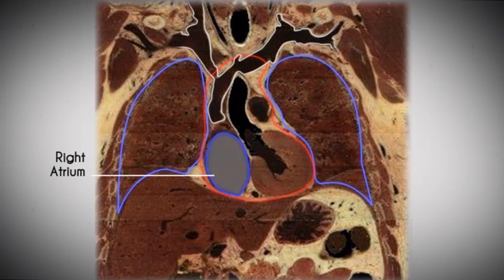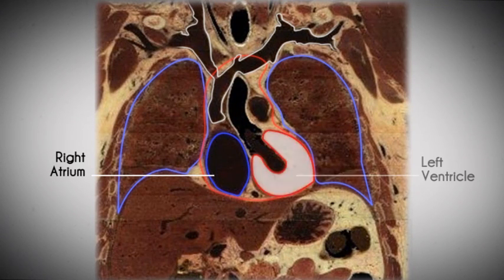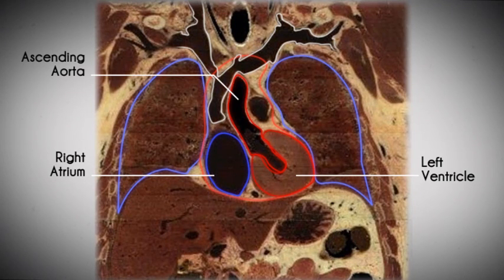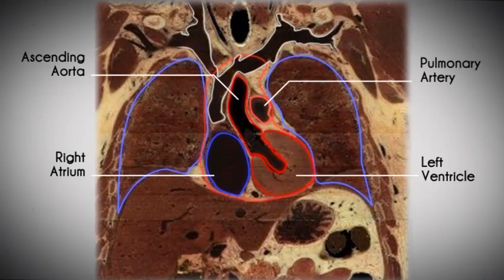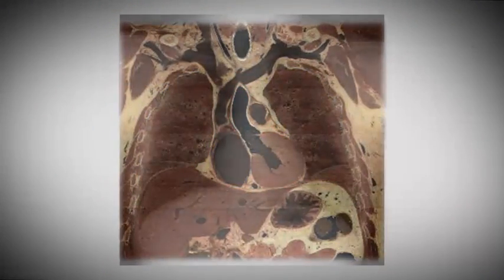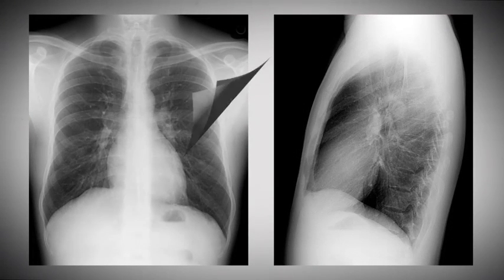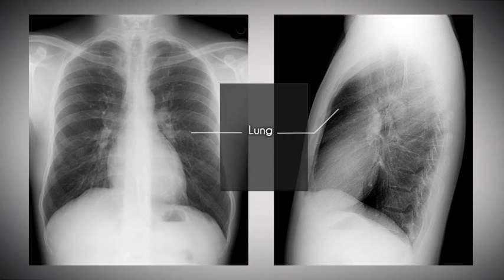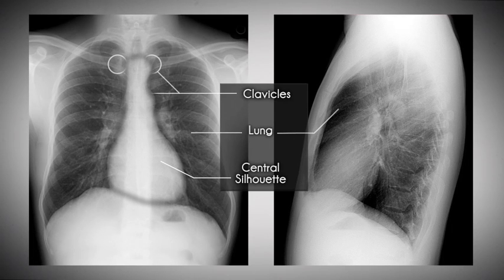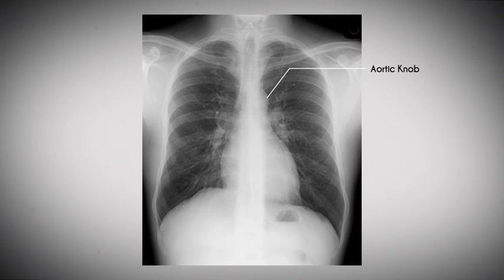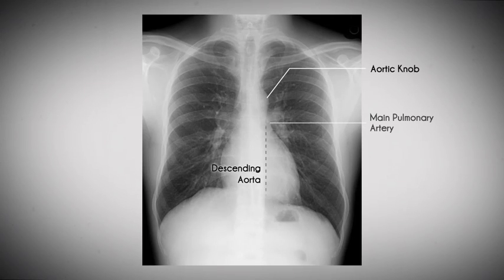Notice how the right atrium forms a part of the patient's right heart border, how the left ventricle forms a portion of the patient's left heart border, and the location where the ascending aorta comes up. Also recognize the relative location of the aortic knob or arch and the pulmonary artery. In the normal posterior-anterior and lateral chest X-ray films, the inflated lung and pleural cavity, the medial heads of the clavicle, and the central silhouette including the heart and great vessels appear. Also shown is the knob of the aorta, the descending aorta behind the heart, and the area of the left main pulmonary artery.